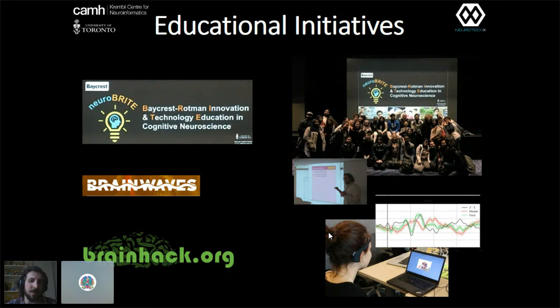We were going into 3 high schools, and we spent a whole term working with high school kids, final and penultimate year, on a Muse EEG based cognitive neuroscience project. They designed an experiment, they ran an experiment, looked at the data, and presented their results in a little conference workshop thing that we organized, and they did something that's I think really unique but possible at the high school level and at the undergraduate level.